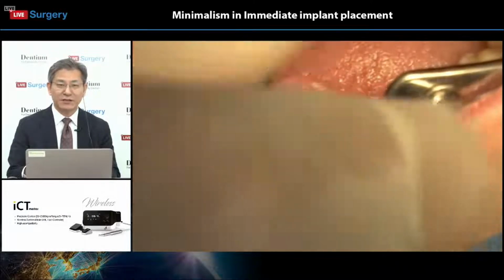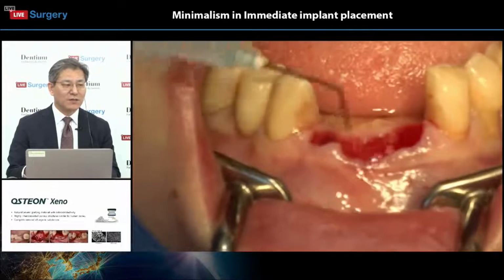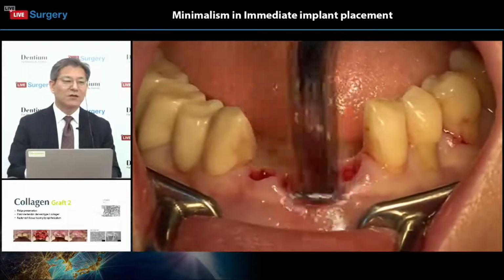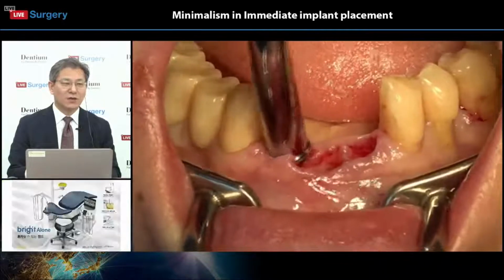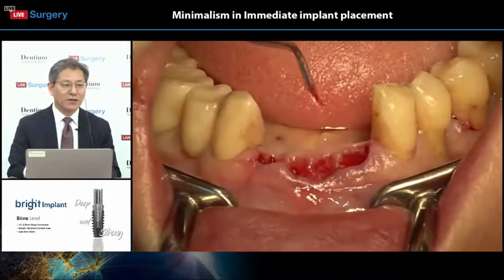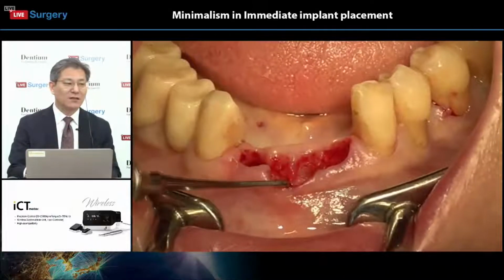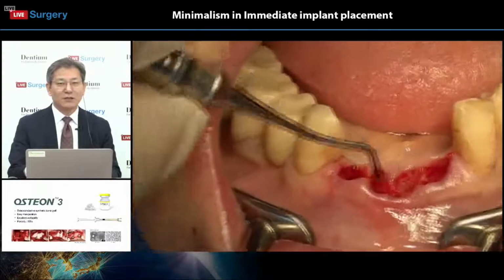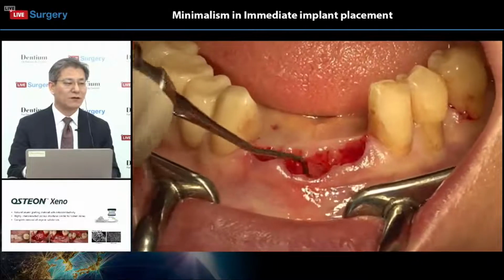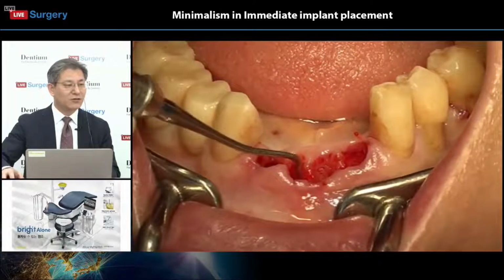This lower anterior area frequently undergoes immediate implantation because of the site characteristics, as you know. Even though it is a periodontally compromised situation, the shallow root gives us a better condition when we drill for initial stability, right? Even though some bone resorption can happen, it is not a critical part for drilling and getting immediate implantation and insertion torque. Okay, so all the granulation should be removed.